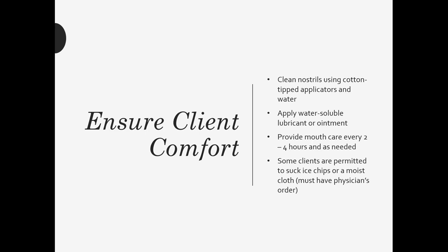And then it's important to remember to do mouth care because they have this NG tube, so they're probably NPO, meaning they're not drinking, they're not eating anything by mouth. So we want to make sure we're still taking care of their mouth, having them brush their teeth or whatever. If they need you to do it, help them with that. And then some clients can have some like ice chips or maybe like a moist cloth.